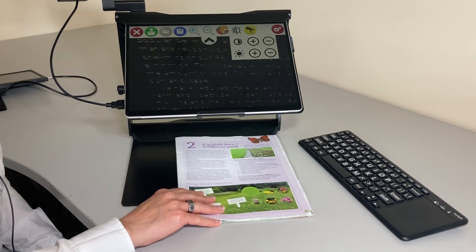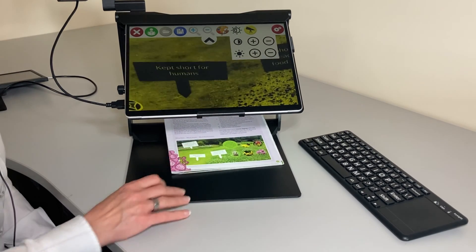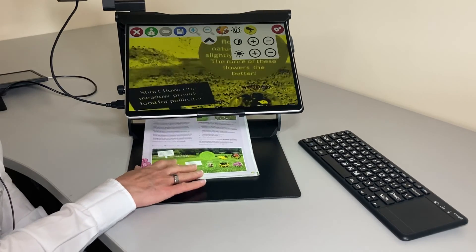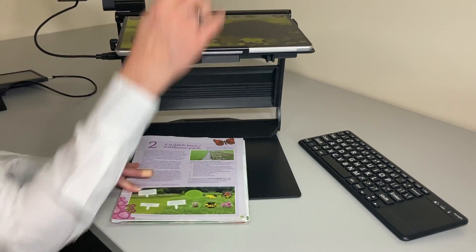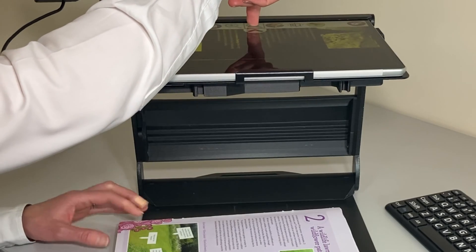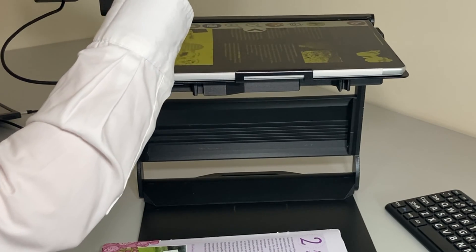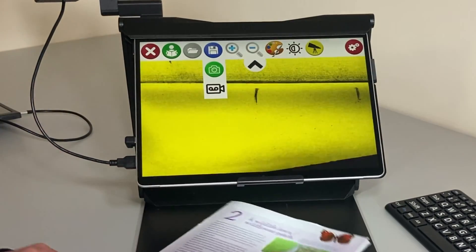We can move our book back and forth and go right down to the bottom of the page where there are pictures and text. If this is difficult to navigate, we can take a full page picture. We just spend a little bit of time lining it up, zoom out, and get a whole A4 page in view, then refocus.